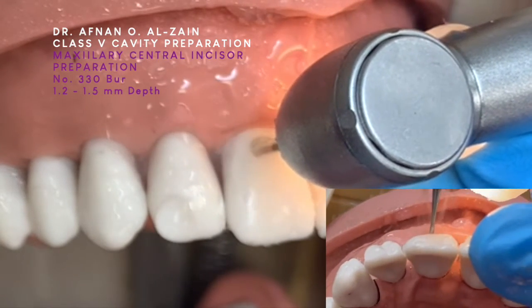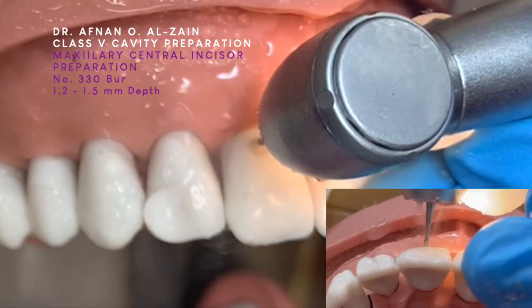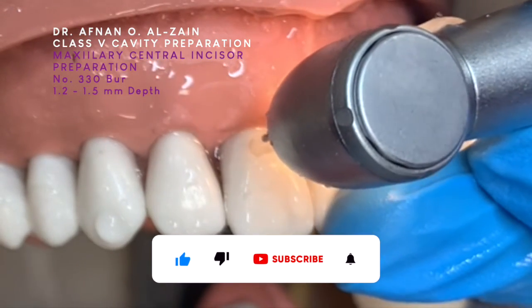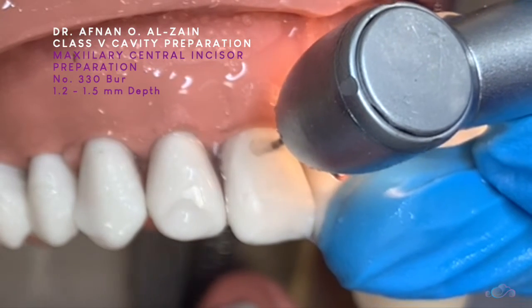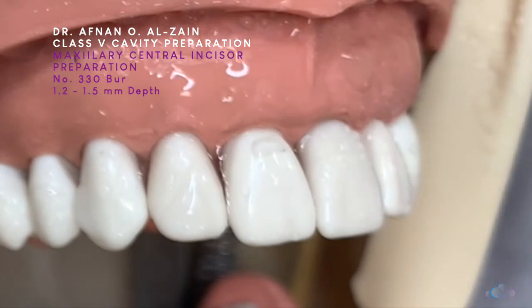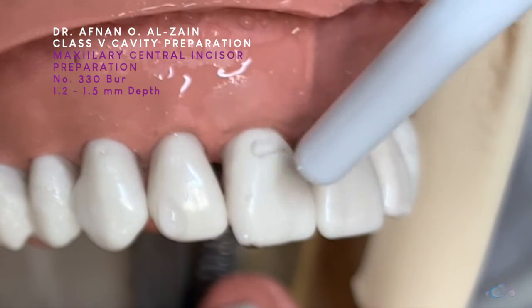And as you can see, the tooth is a bit convex. I want to follow the contour of the tooth. We want the depth to be met in the entire cavity.